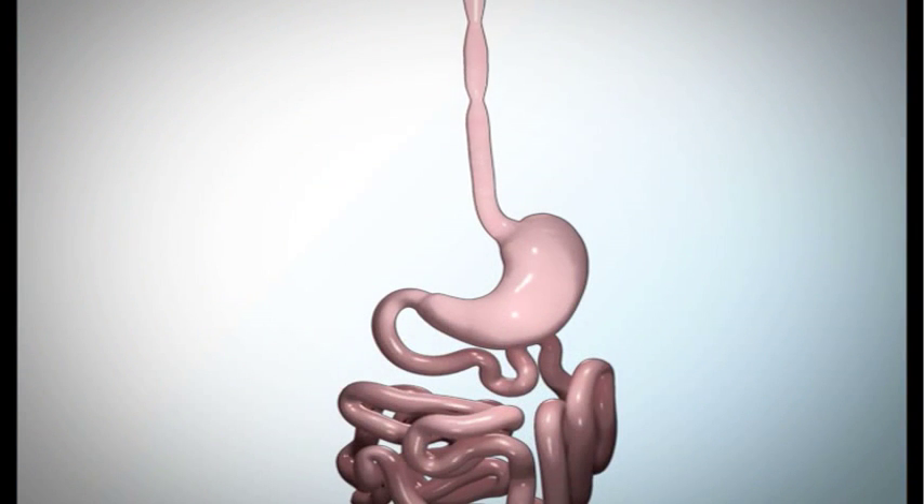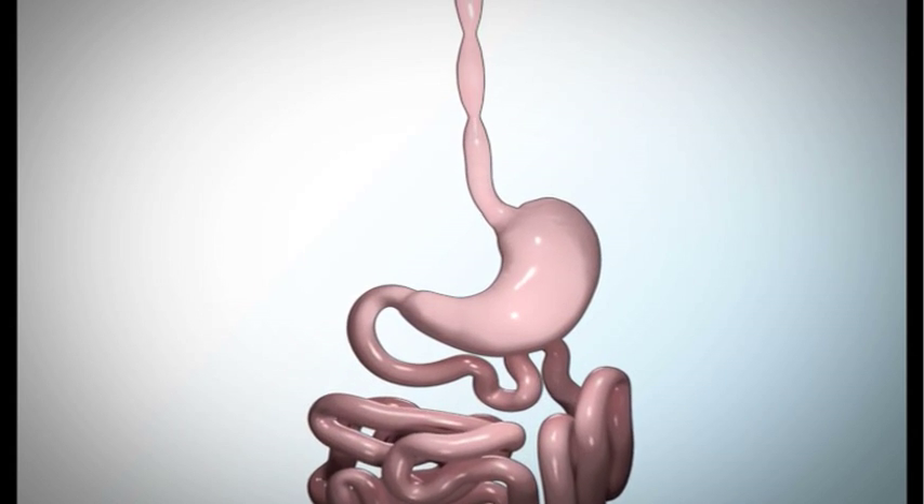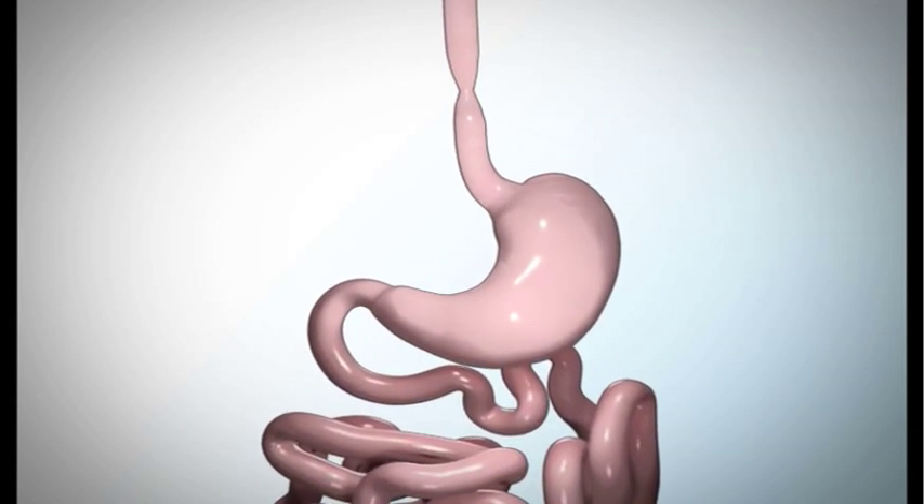This educational video will explain the normal process of digestion, the laparoscopic adjustable gastric band procedure, and how weight loss will occur upon completion of the surgery.